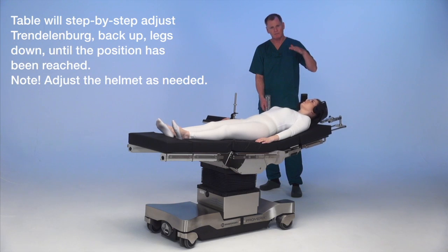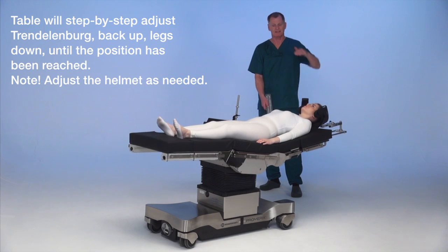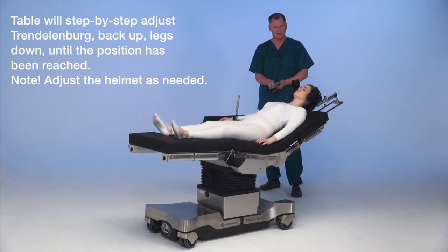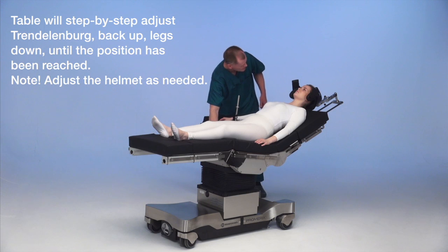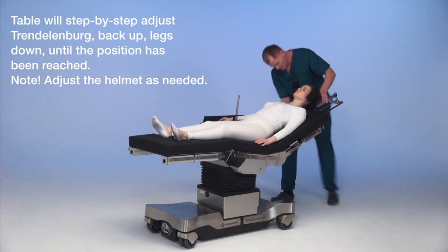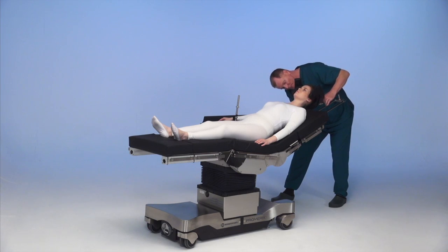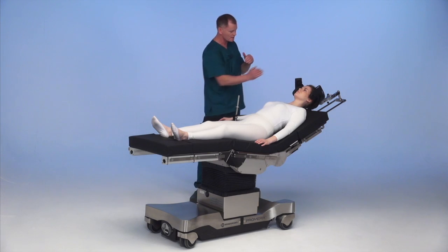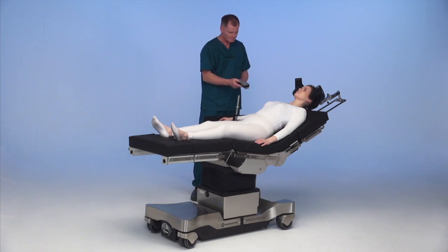It's going to go Trendelenburg back up, leg down, Trendelenburg back up, leg down, and get to a general seating position. You're going to want to go further as you go along. Now we have to stop and adjust the helmet — normally in the operating room there will be several people doing this, including the surgeon. We need the helmet to ride up and down as she moves into position. I'm going to hit the beach chair button again.